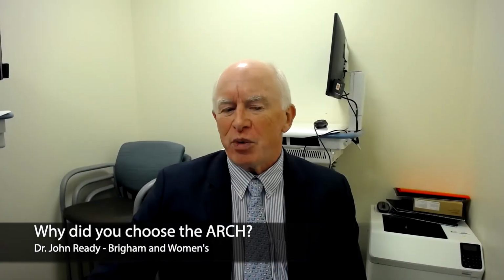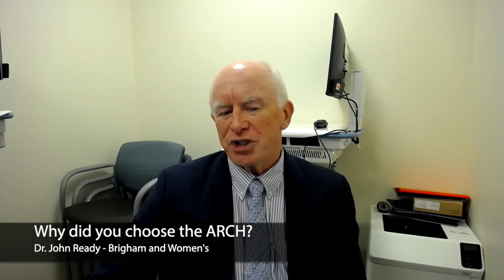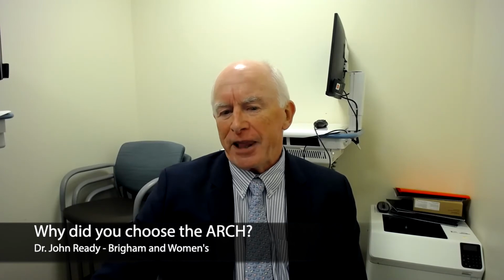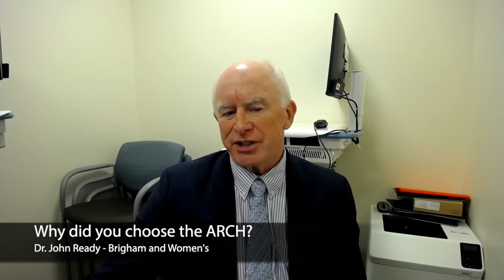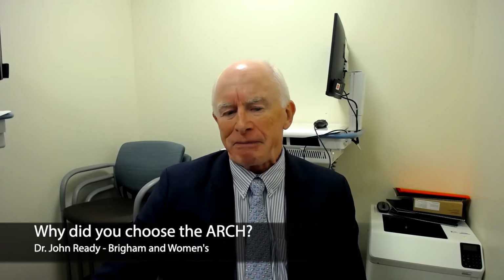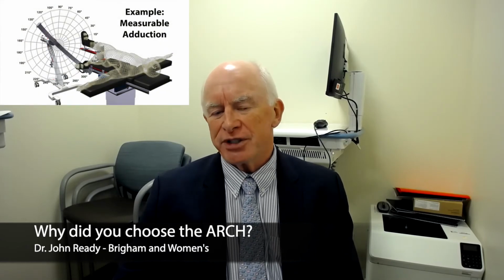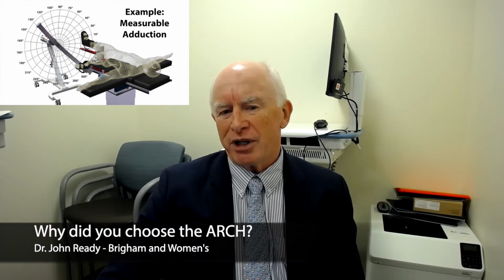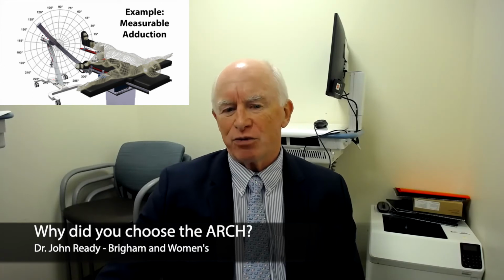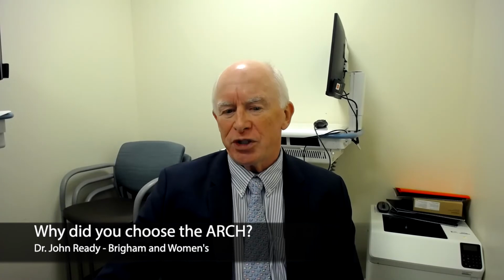The reasons that we went with the arch table were that when we called out what positions we wanted the leg to go into, the PA or whoever is running the table, sometimes we have an assistant run it at one of the other centers, they can actually just listen to what we say from the point of view of the numbers, and they know exactly where to put the leg. Whereas we found with the Hana table, it's not marked off specifically as far as clicks and rotations. And if you have a good assistant, they'll know what to do.